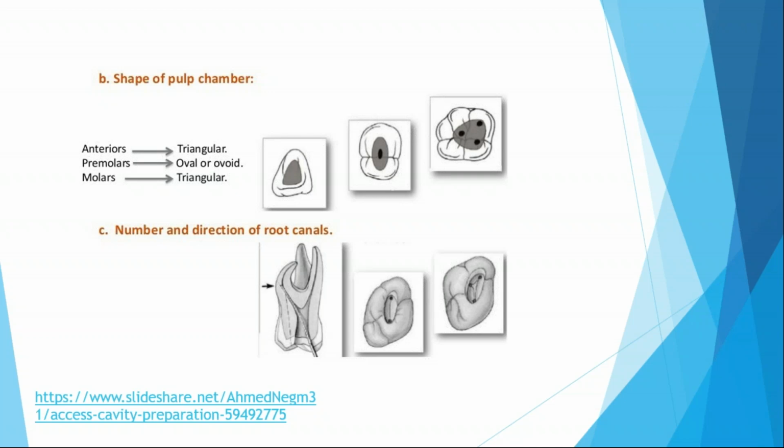I remember on Albor's presentation, one of the things that he was talking about was through his microscope endo, he creates such a small access point that he can only see one canal at a time. Some of these are, I'm sure, older images, not real minimally invasive as far as access goes. But still, it's a great overall anatomy of what you'll end up looking like. Excellent work on that.